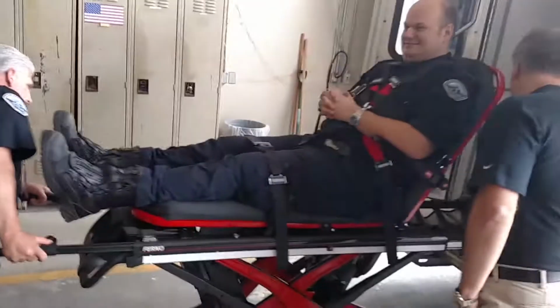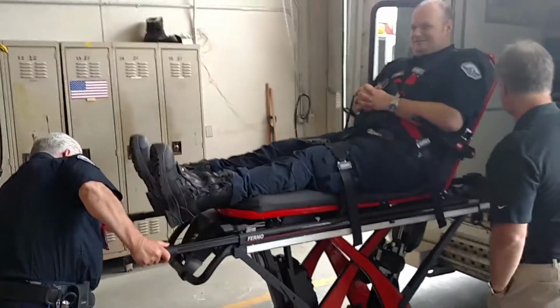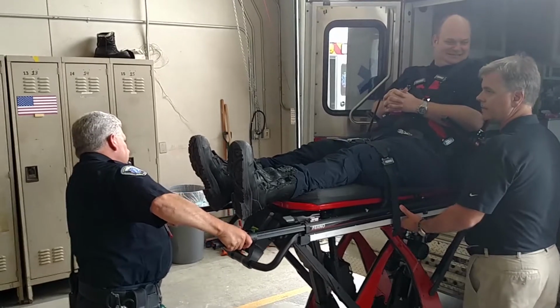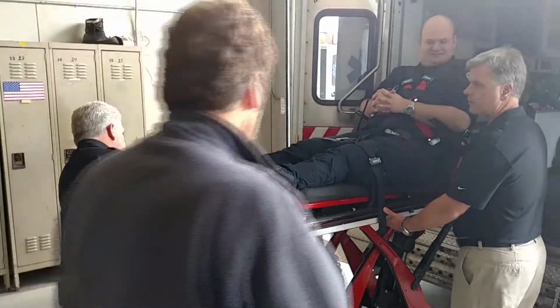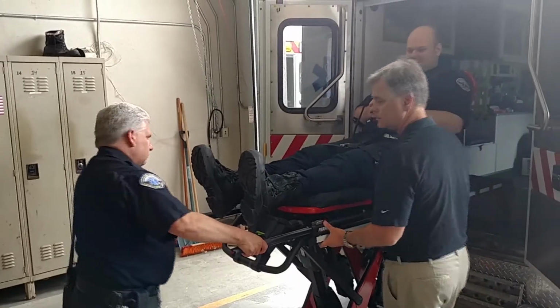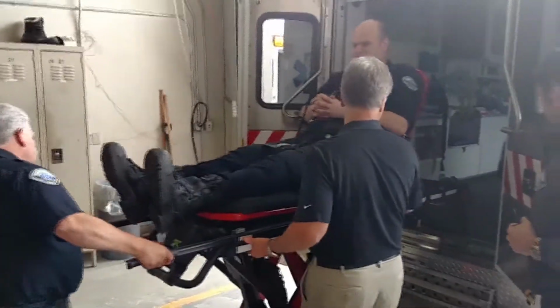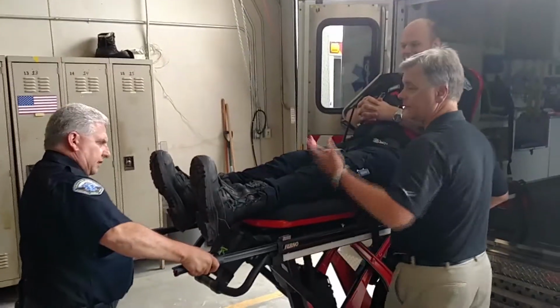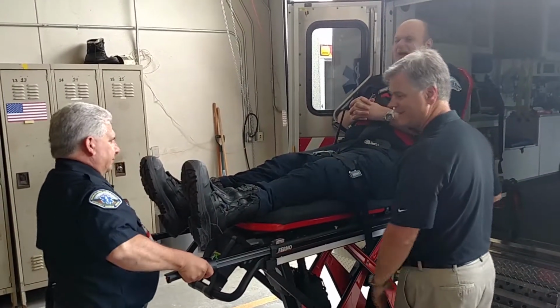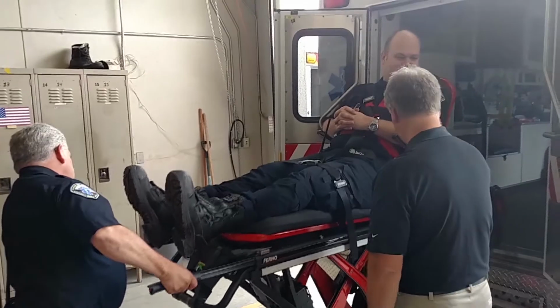Yeah, come on up. And I can also show you how to set the load height on this, so you can set the load height on the fly. So if you have vehicles with different load heights, okay, stop. You're going to come back into the hook. There you go. Otherwise, if you'd tried to come up, the legs would be underneath the bumper. All right, so hit your minus button.